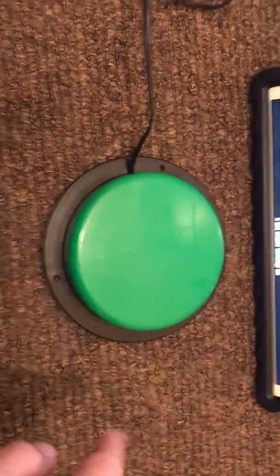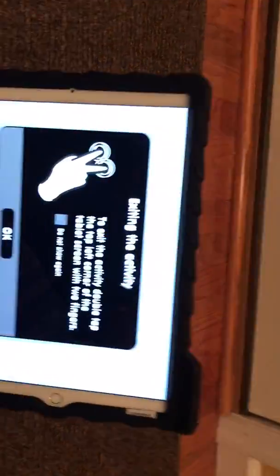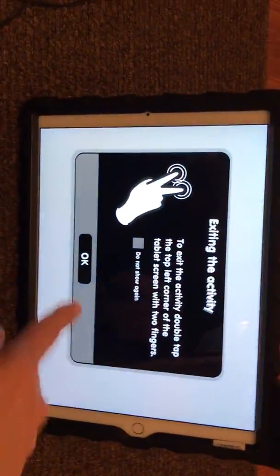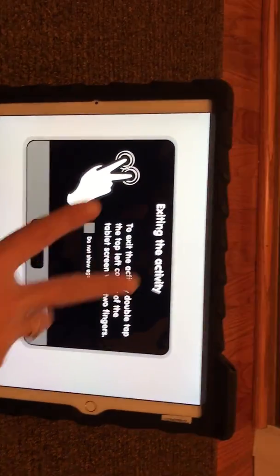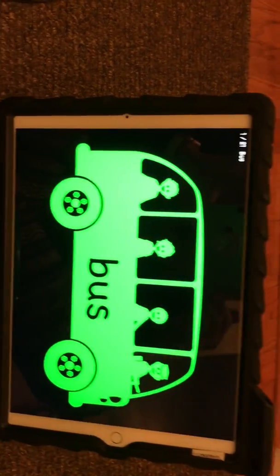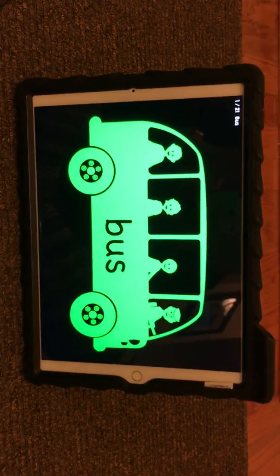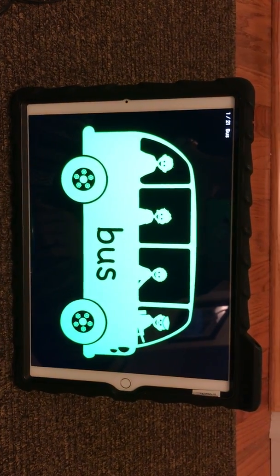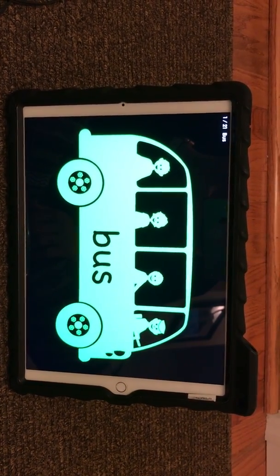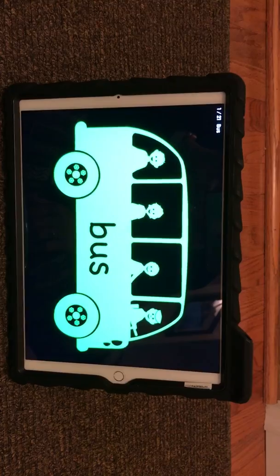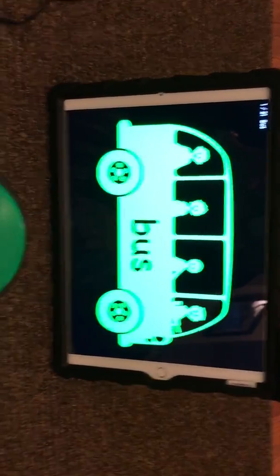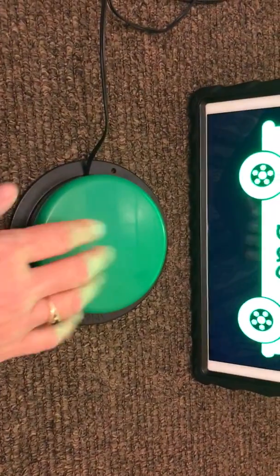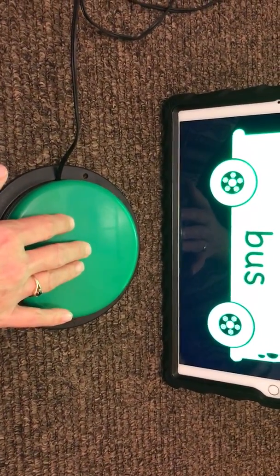We can start it. It tells us if you want to exit, you have to put two fingers in the activity. Here's what happens: the bus will give you an auditory prompt, and in order to make the bus move and play music, the switch has to be activated, so you can hit the switch.